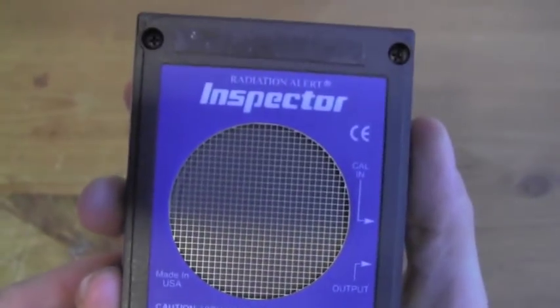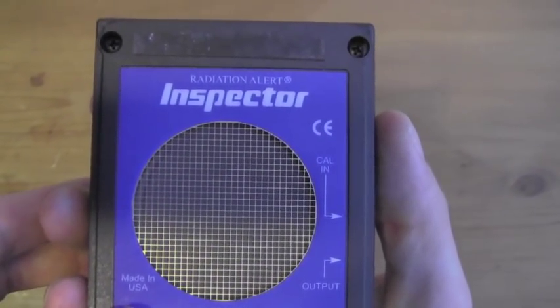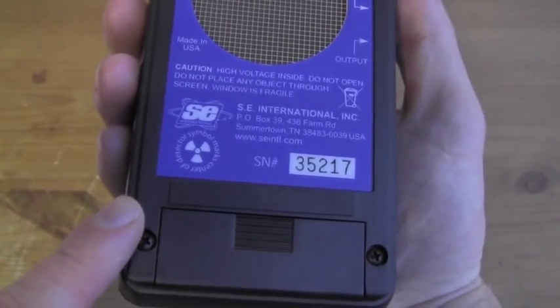On the back, we have the protective screen covering the thin micro window of the internal halogen quench GM probe. Here is our battery pack which contains one 9-volt battery.